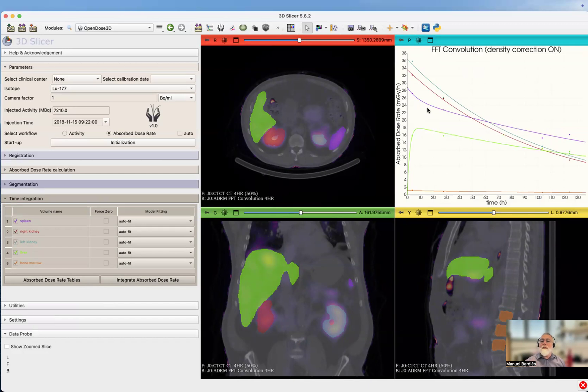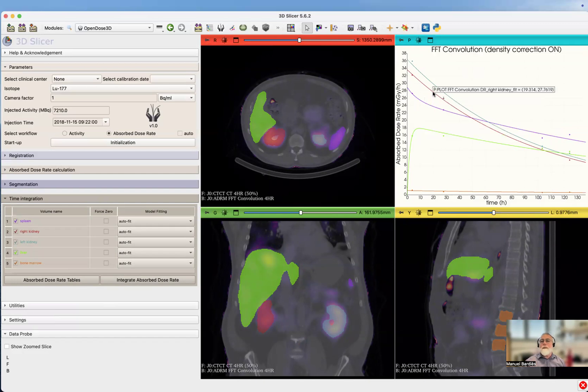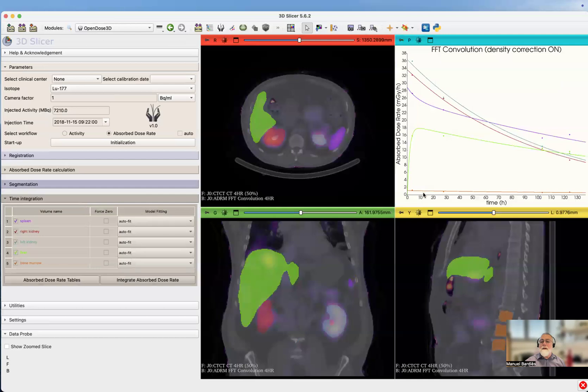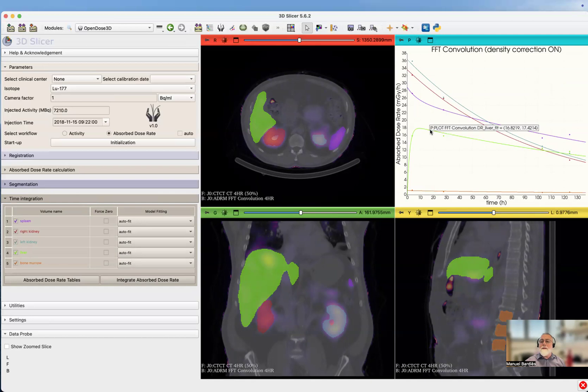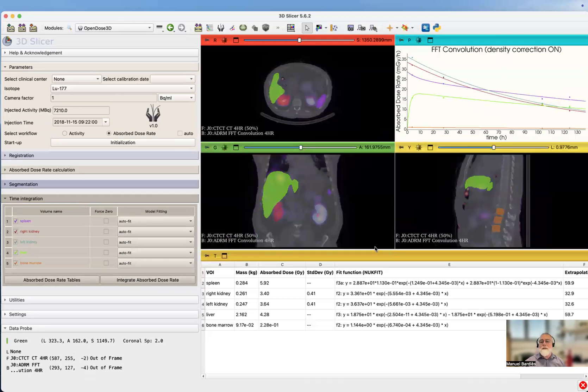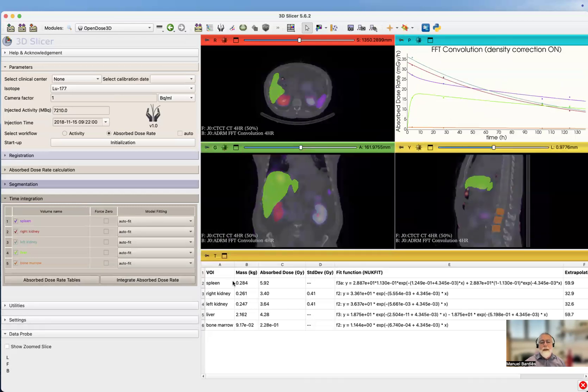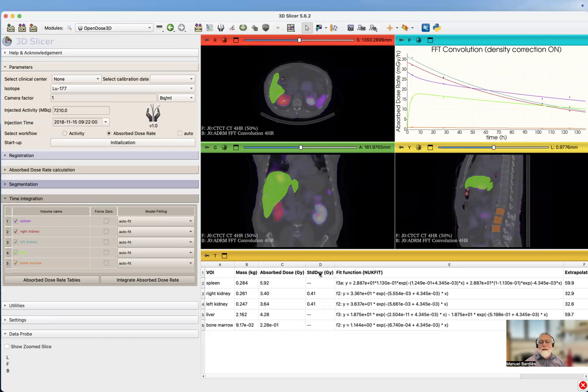You've got the different files. You can see here it's the liver, here is the spleen, here it's the right kidney, left kidney, and bone marrow at the bottom. You can see here that it's already fitted. We're going to see that more if we integrate the absorbed dose rate table. We have a result.